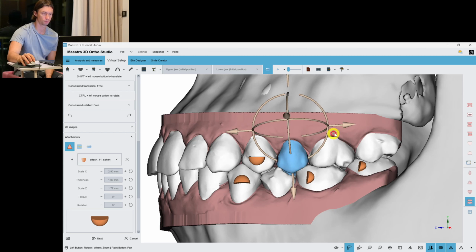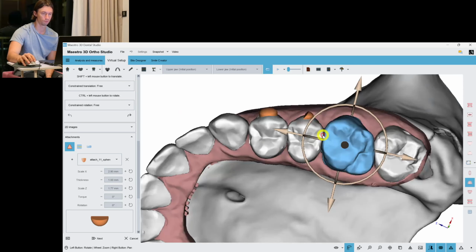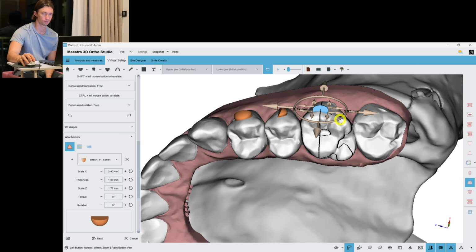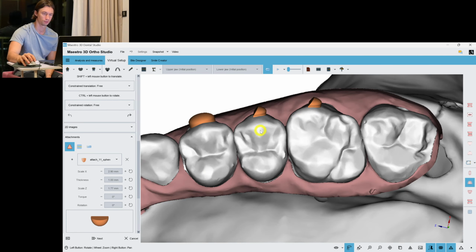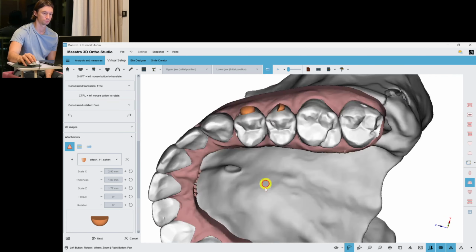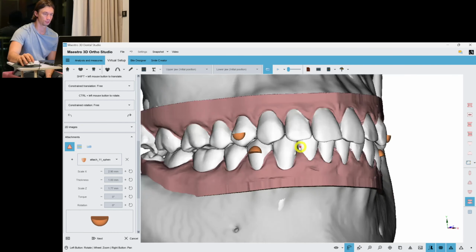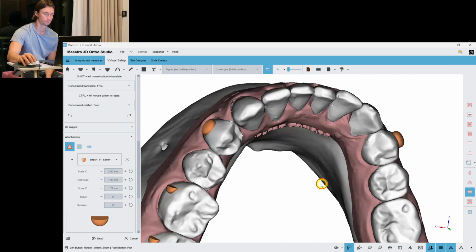I don't think we need any attachments on the upper jaw, maybe here. We don't need attachment for distalization because we have very big natural surface of the molars. So imagine if we just add an attachment here. Does it give us any sense? I think no, because we can push here, here, here, here, and there. And on the second molar it's the same, so we don't need any artificial surface here. So I'm not a big fan of placing a lot of attachments. I always try to avoid them if I can.